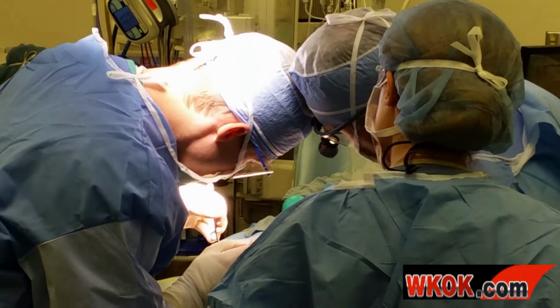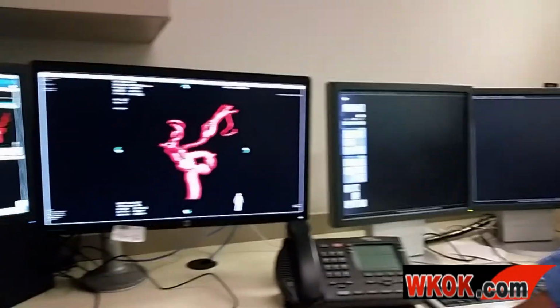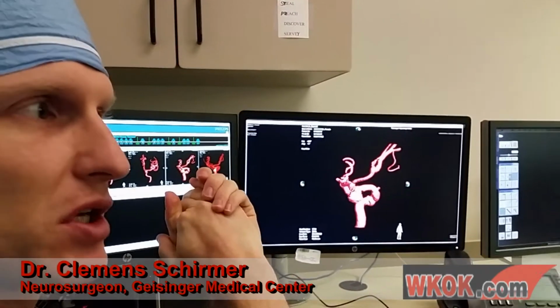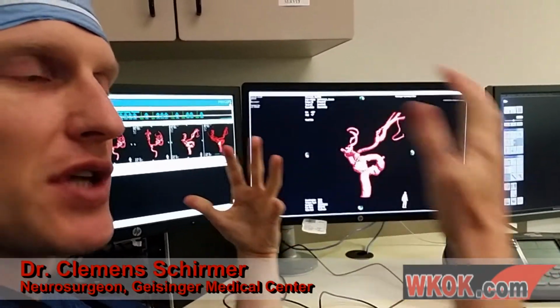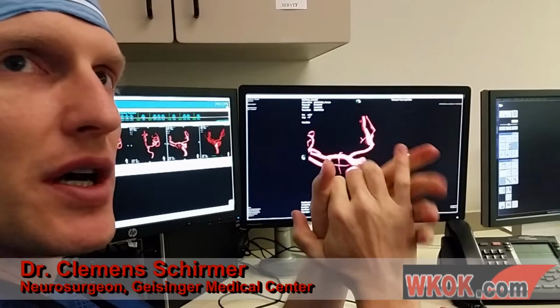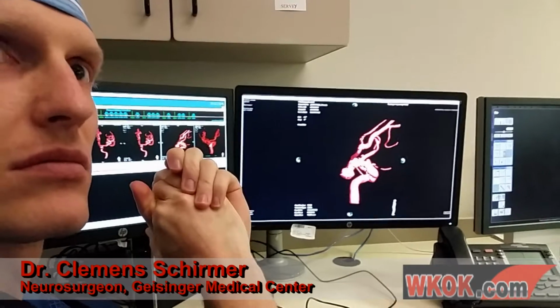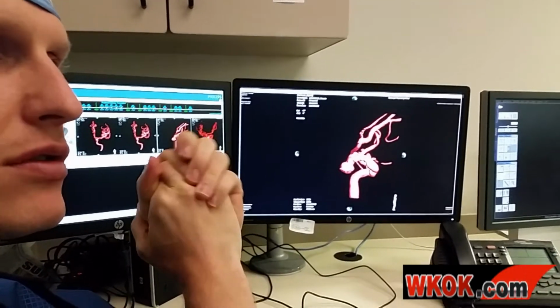The pipeline stent is now becoming the preferred way to treat an aneurysm. It's going to be a scar tissue that's sitting inside of the skull, but because it's relatively small, it's not affecting her brain. And because it's not pulsating or moving otherwise, it's not going to do anything. And that thing can stay up there for the rest of her 30 years plus, hopefully. Yep. Okay. It's like having a golden tooth in your brain.